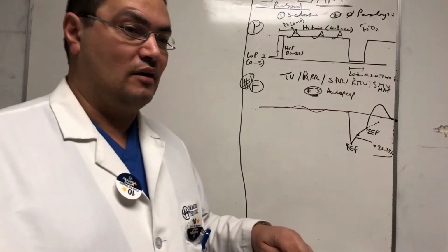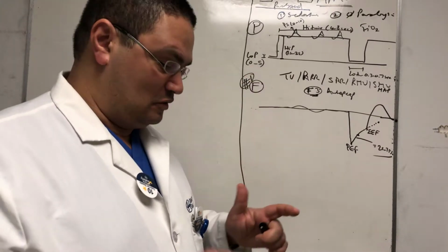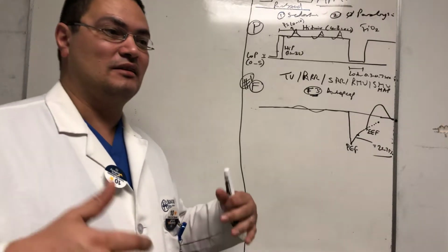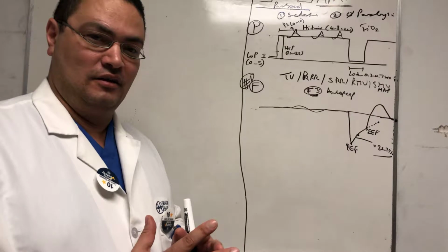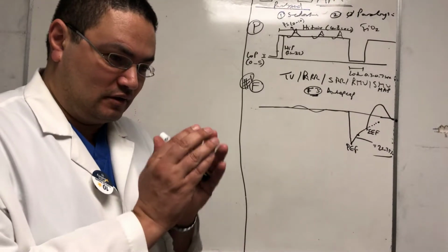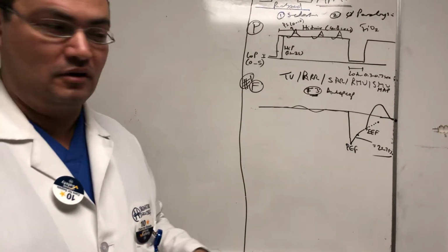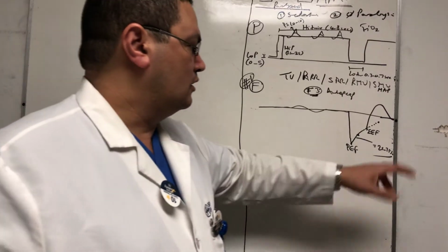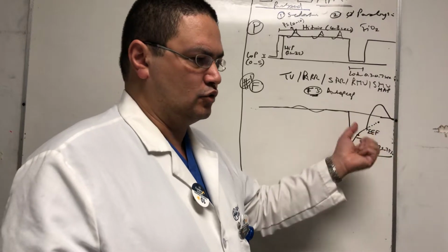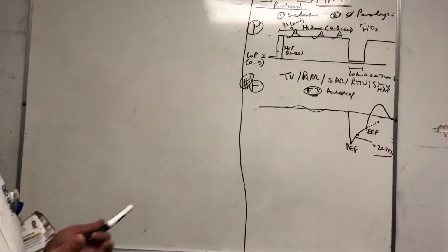That means that the lung now is seeing what pressure? So now you achieved a pressure inside the lung of 0 or 5. That means that the ARDS lung is completely deflated, and you have to reopen it again on the next breath, and it's going to injure every time you open it and cause more cytokine release and stuff like that. So that means de-recruitment. If the ratio is low, it means de-recruitment, and you need to shorten the time. Okay, that's the simple way of looking at it, and that's another claim to fame of this mode.